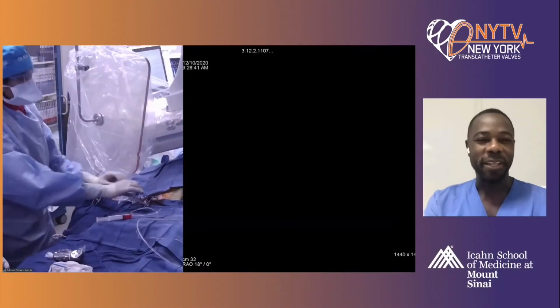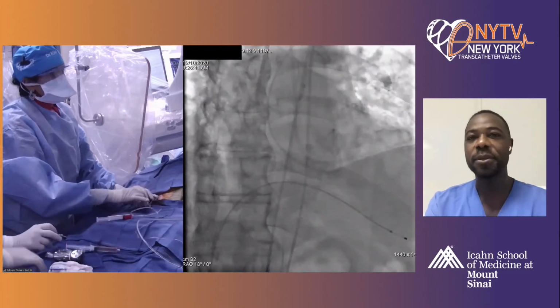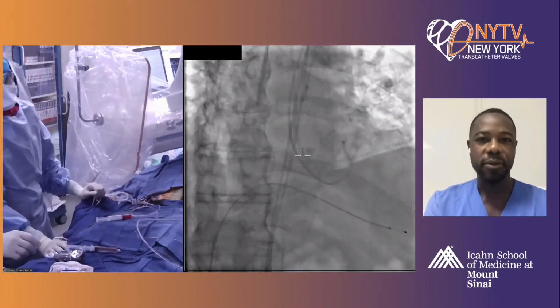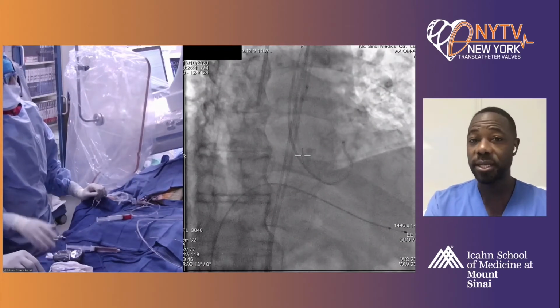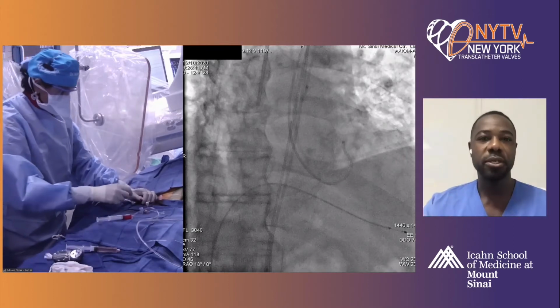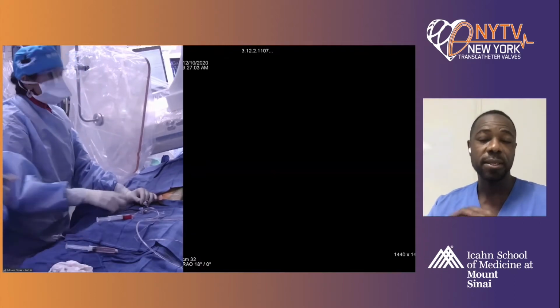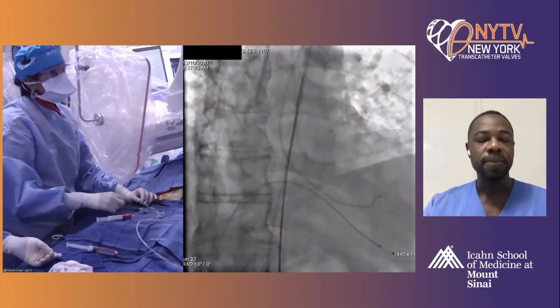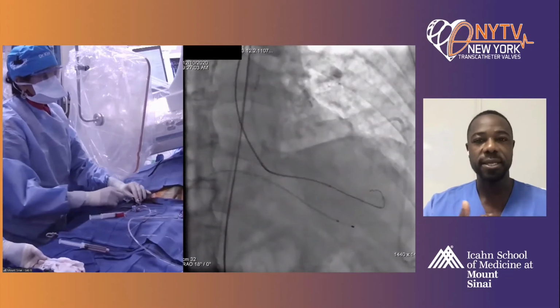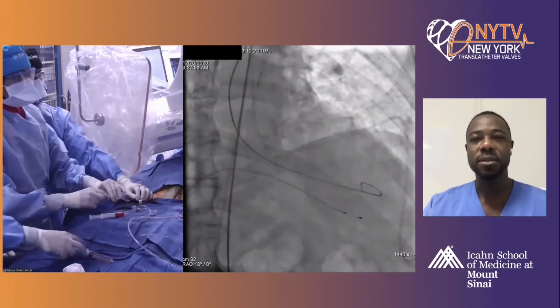Thank you. Good morning, everyone. So just to make it brief, I would say that for bicuspid aortic valves, you can use whatever device you want. Here it's more about the matrix of the patient. As we are facing a very large annulus, we don't really know the configuration of the supra-annular region, but here I estimate that it's more like a flared configuration. So definitely the Sapien 3 is the most appropriate device with additional CCs. If the dimensions were a little bit smaller, an Evolut Pro would have done the job beautifully in that case also. So every device works. In this particular case, I would stick to the Sapien 3.